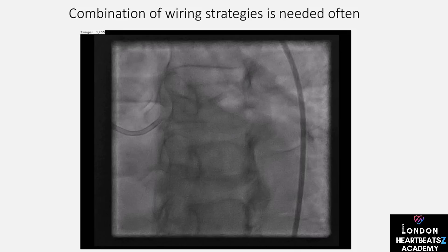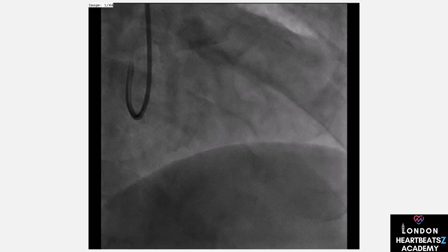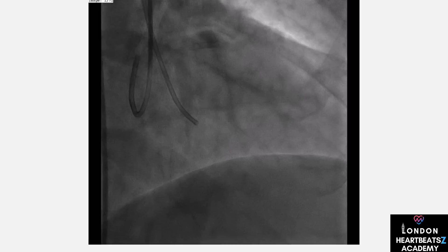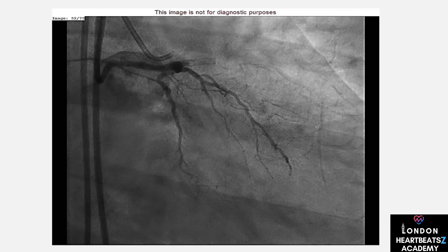Parallel wiring is like having a second set of eyes on the road. We use a second, harder wire with a different tip direction, keep the microcatheter in the first wire if possible, and use double-lumen catheters for added support. It's a team effort to navigate the occlusion successfully.